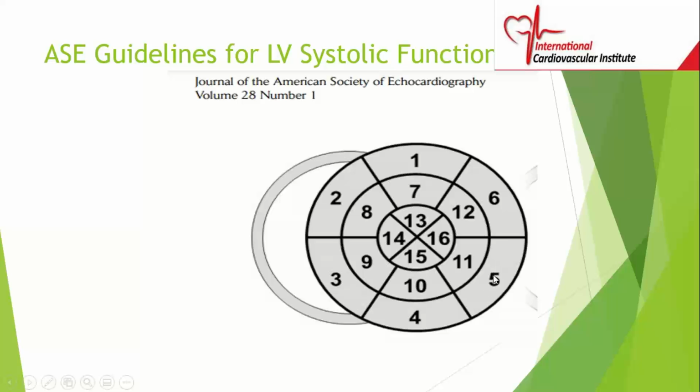And 5, which is close to the inferior wall, is the inferior lateral wall. So you name all 6 segments of the basal: anterior, inferior, anterior septum, inferior septum, inferior lateral, anterior lateral. Simple.